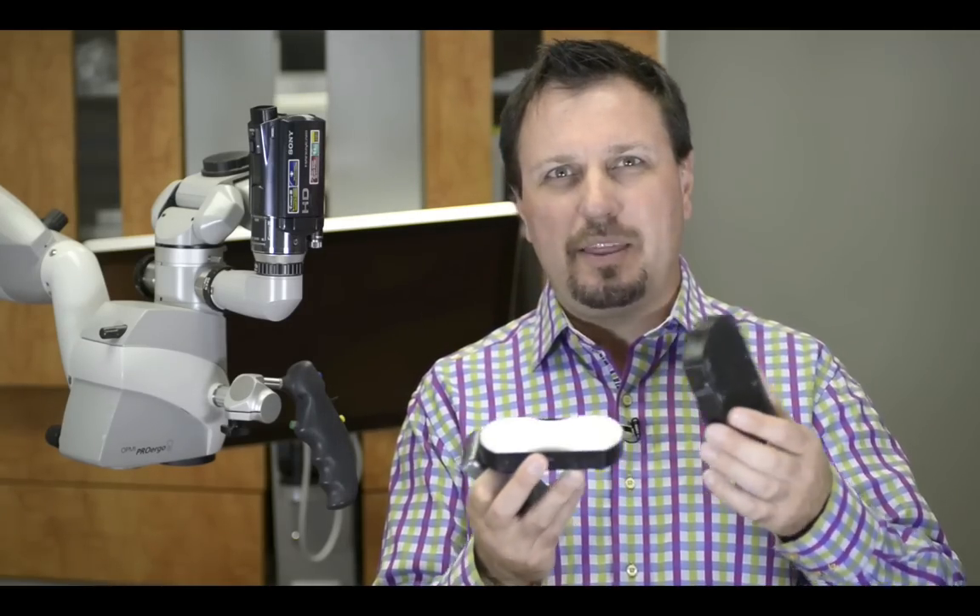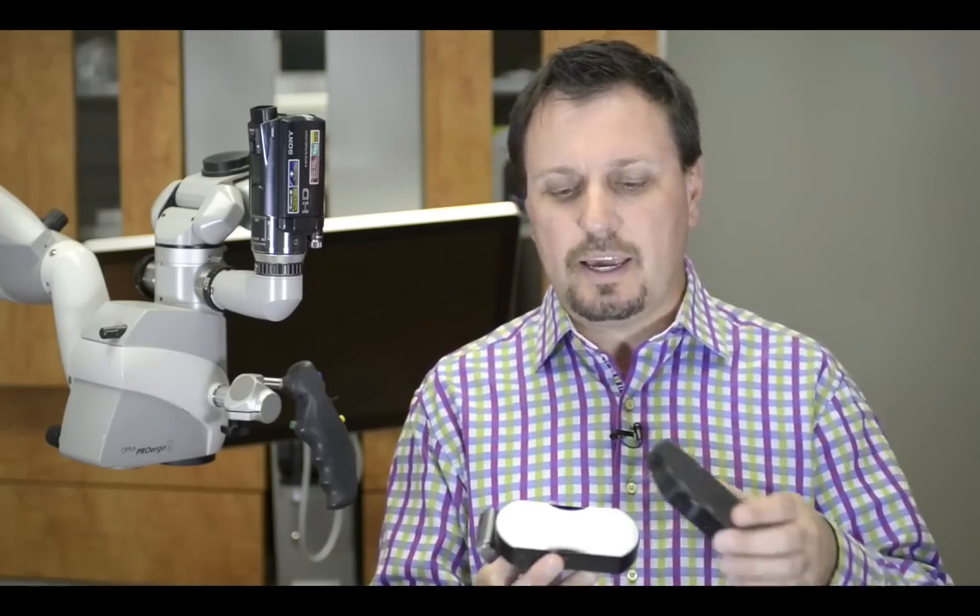In this particular video, I want to share with you a little tool that I use in the practice, especially with veneer and jacket crown cases — veneer cases specifically more frequently. It's just a little box we use called the Resin Keeper. I've talked about this before, but I thought I'd share and show you what it looks like.